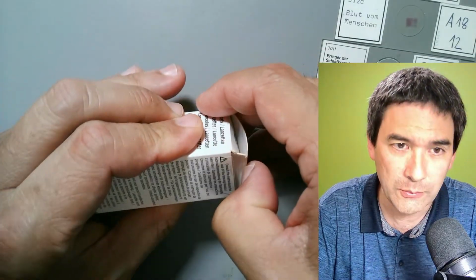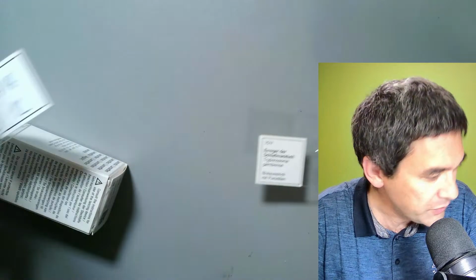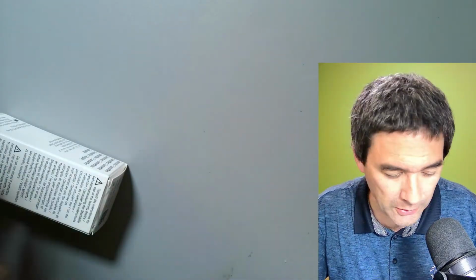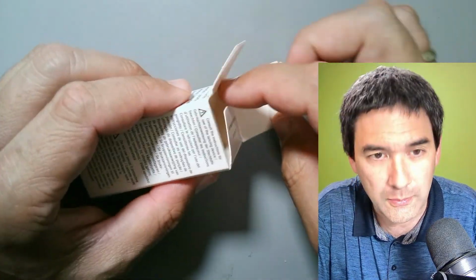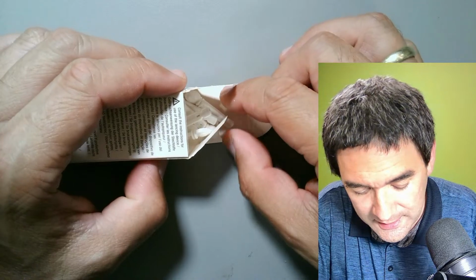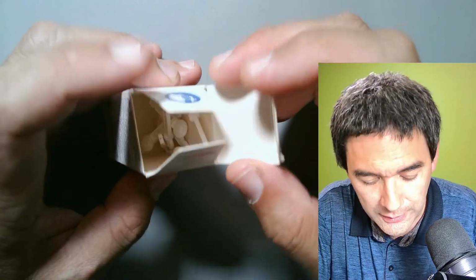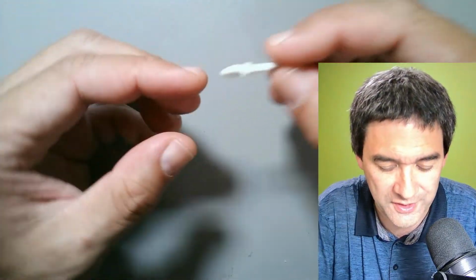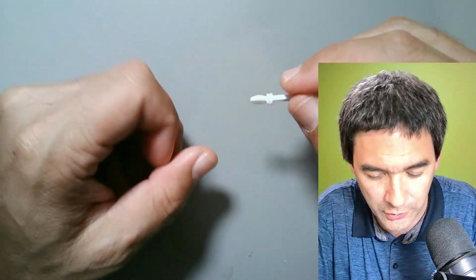So what I'm going to do now is show you something scary. I'm first going to remove those slides here, because I do not want to get them covered with blood. Something that I bought some time ago: these are sterile lancets. They look like this, and they're used to prick yourself to draw some blood. I say scary because they're scary, right? It's a lot of psychology. There's a protective cap here, and you have to prick yourself, and I'll press some blood out, and I'm going to put it under the microscope.